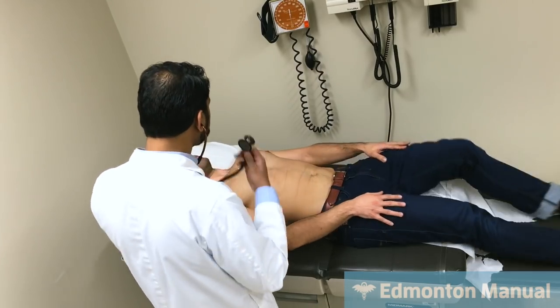Thank you. So that is essentially the key things about using the stethoscope. Again, to recap, harder pressure, diaphragm, light pressure, bell. And when you hold it, be careful that if you're hearing a lot of noise in your ears while your finger's on this side, even though this side is active, you may want to try things like holding it like this or putting your fingers like this. Just play around with it and see what works best. We're now going to move on to our next instrument.